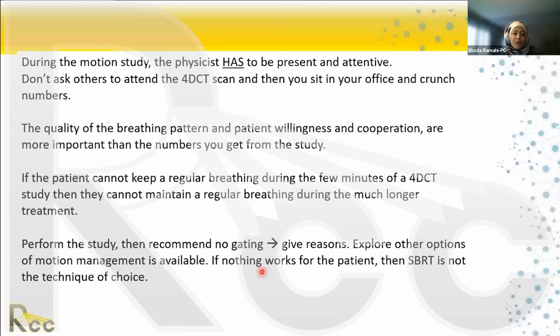So you have to make sure that there is enough time and that patients you send to motion management are well selected. And if not, be ready to have other options available that you can also implement.